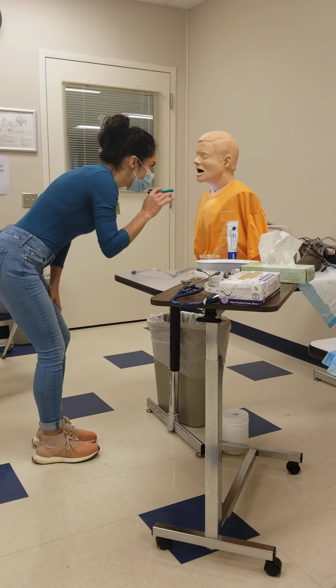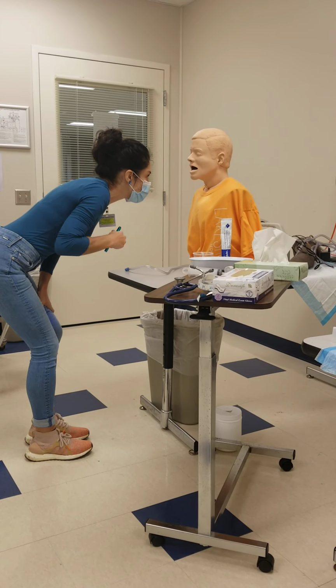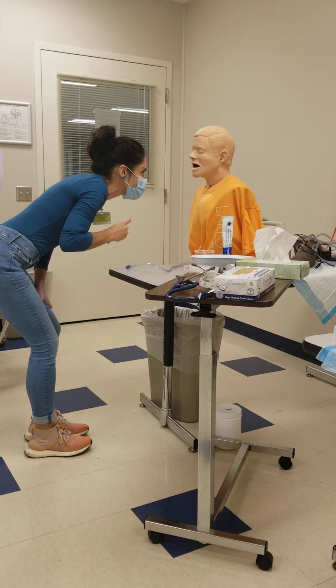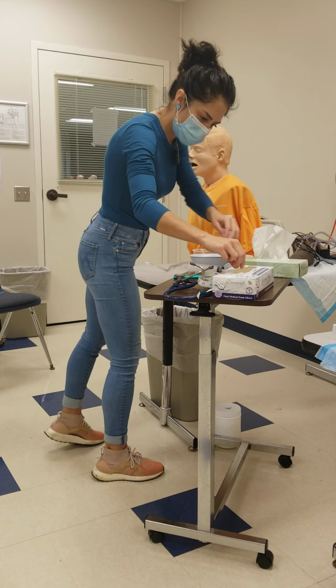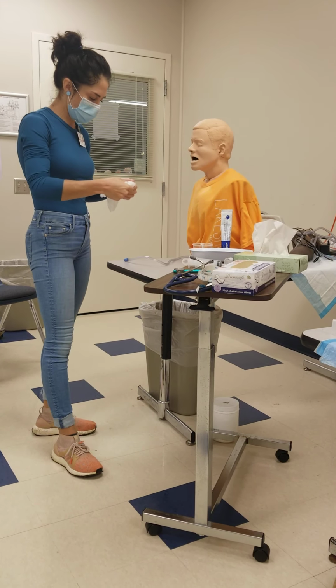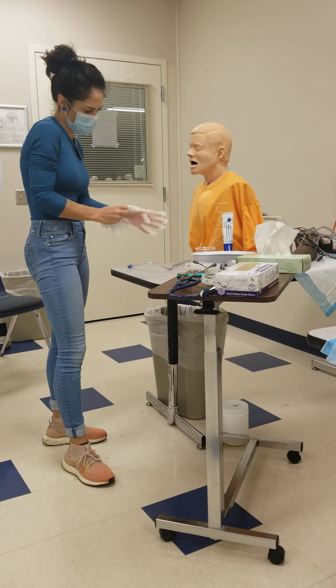I want to look at your nares. Sir, have you ever had any facial trauma, surgery, anything? No? Okay, great. So they're intact. All right. Let me put on some gloves. I will be checking to see which nostril we'll be using.